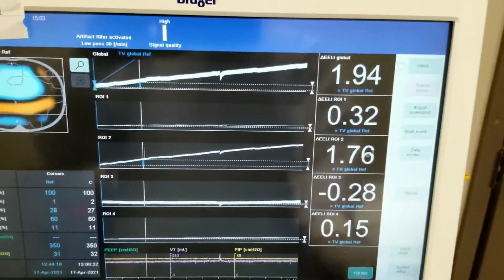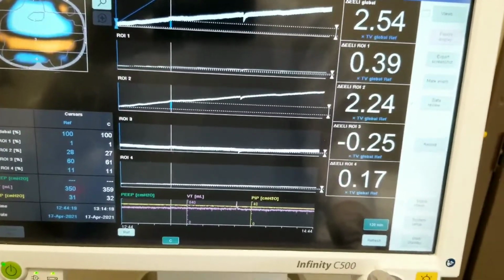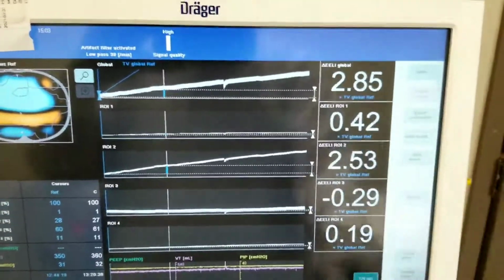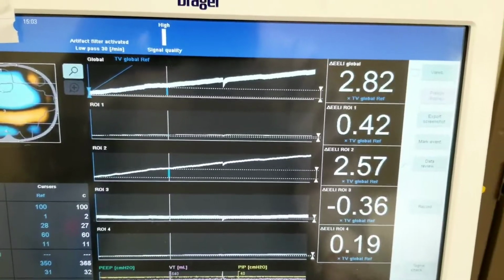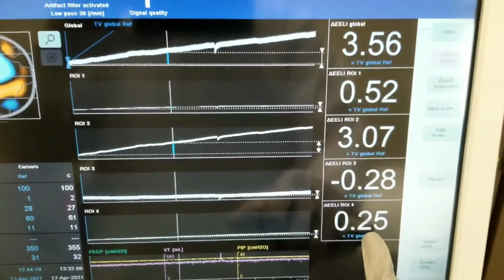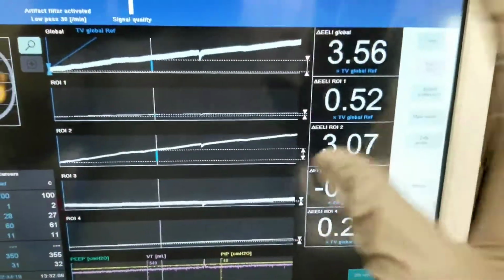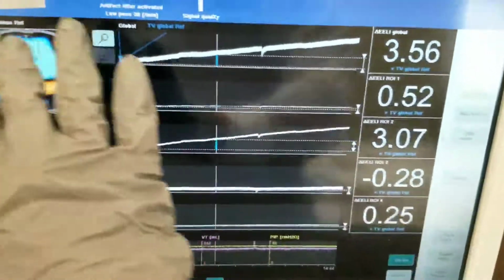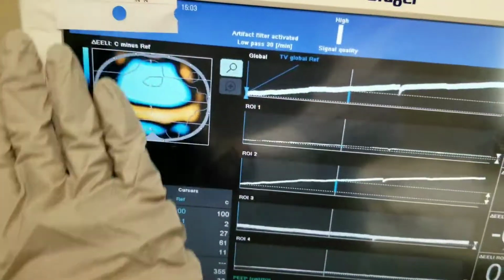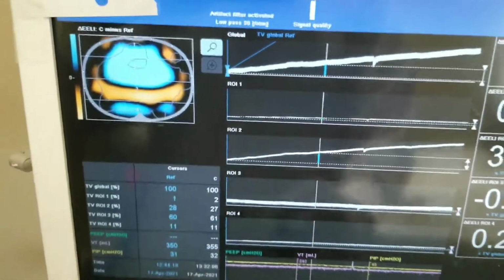All right, so now we see, so this is roughly from 1244 to 114. We're seeing continually increasing impedance over time. And we're starting to see a substantial amount here, which is okay. Again, I keep on repeating it, there was almost no distribution there. So we do want a more well-distributed area distribution of ventilation.